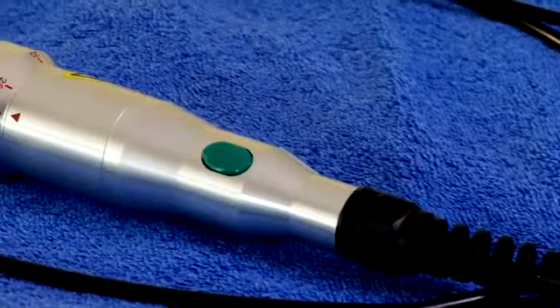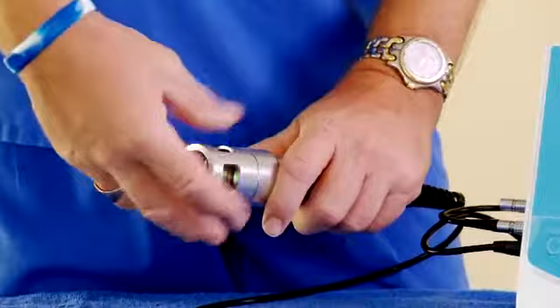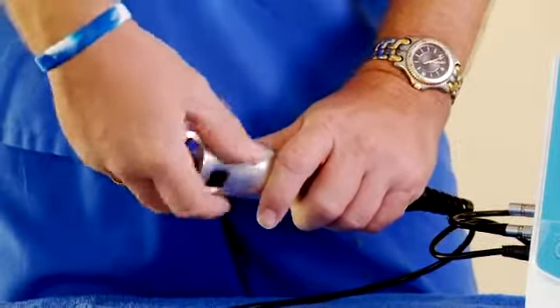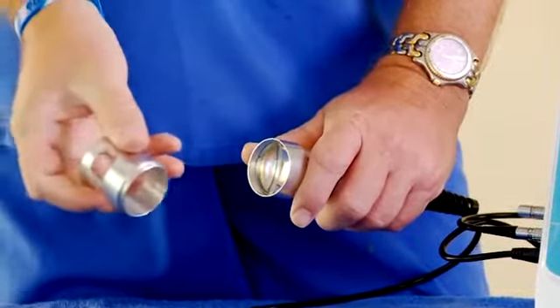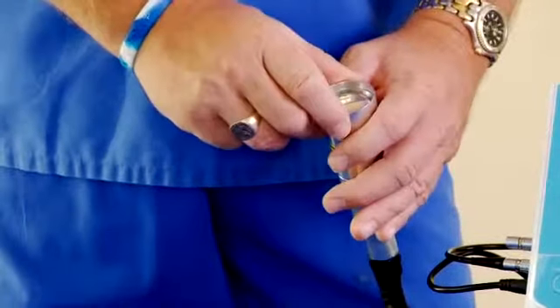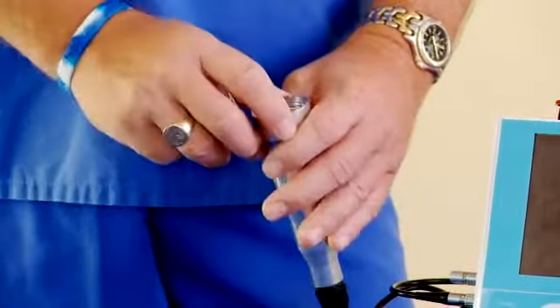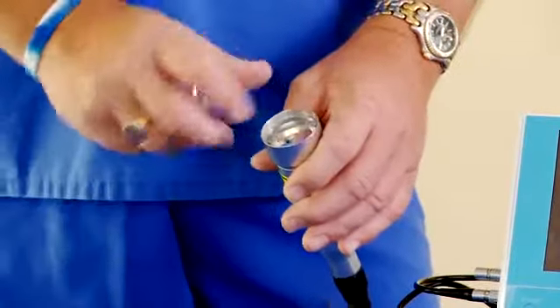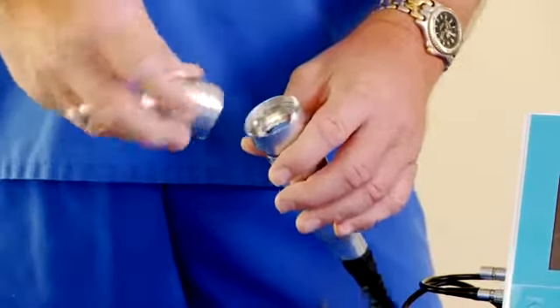To clean the handpiece, simply take off the standoff, unscrew it counterclockwise, just like you would a normal threaded screw. This is aluminum. You can autoclave it. We have a cleaning kit. You need to keep this lens clean of any dander or dust as you treat. Probably every 6 to 8 treatments, you definitely want to wipe this off. If it's a dusty animal, right after that treatment.